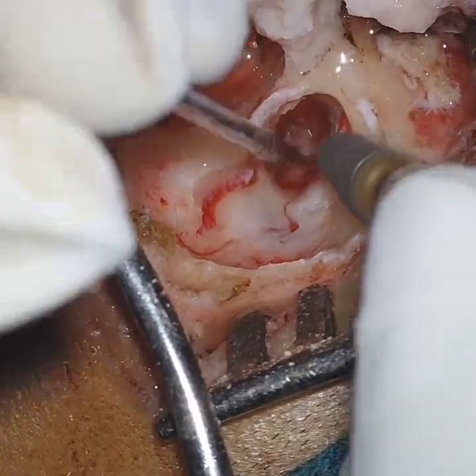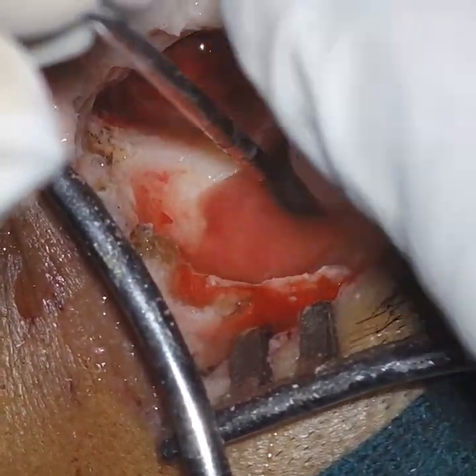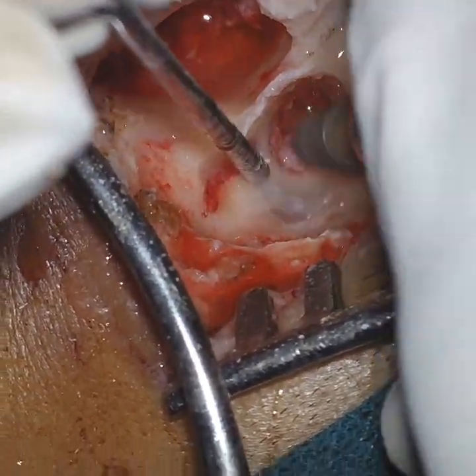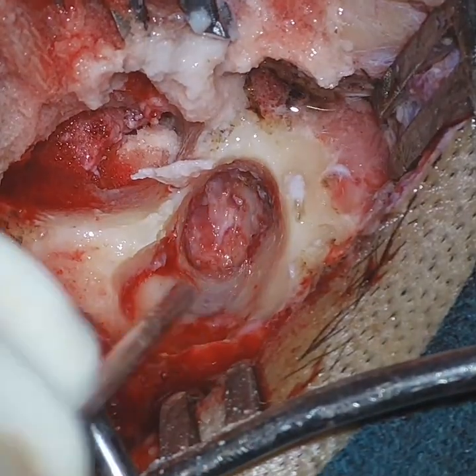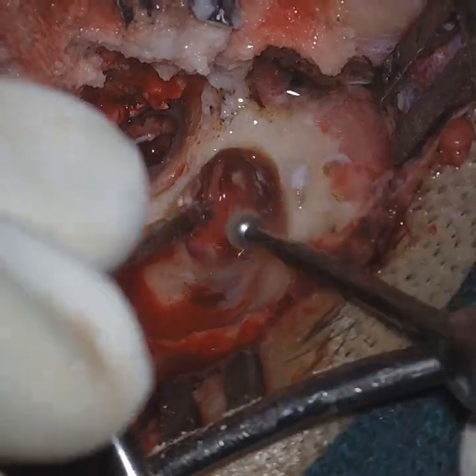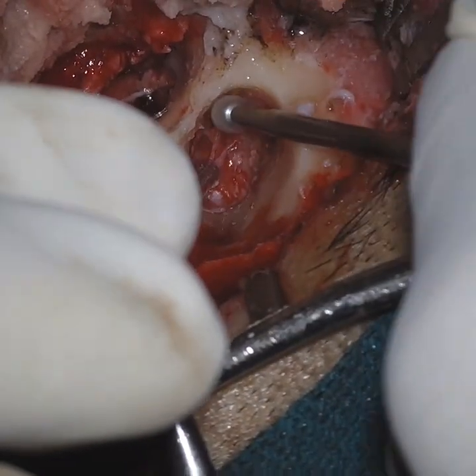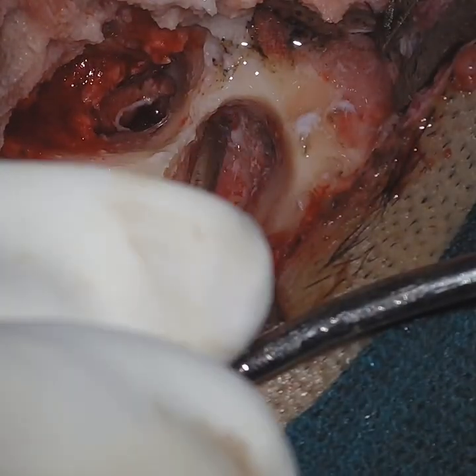So the primary step in intact canal wall mastoidectomy is to make a very good cortical cavity first. So here we are doing a cortical mastoidectomy. It is a little bit different from a standard cavity in that all the landmarks have to be exposed. The lateral semicircular canal has to be exposed and dura has to be exposed and sigmoid sinus also has to be exposed. So here we are making exposure.